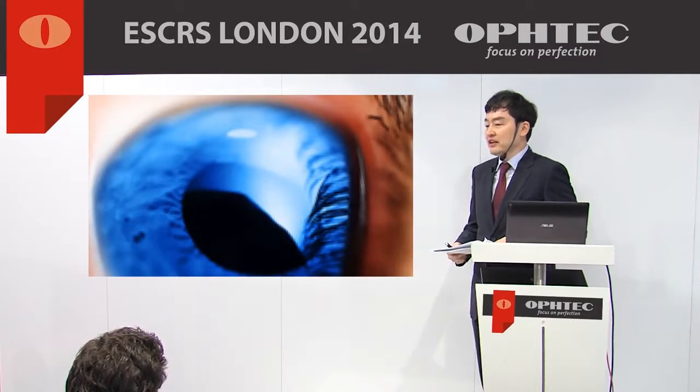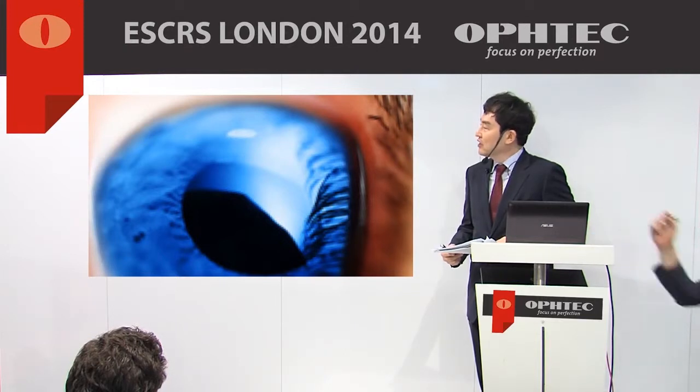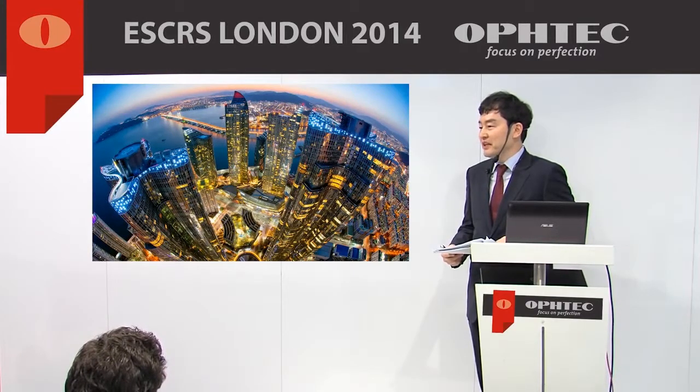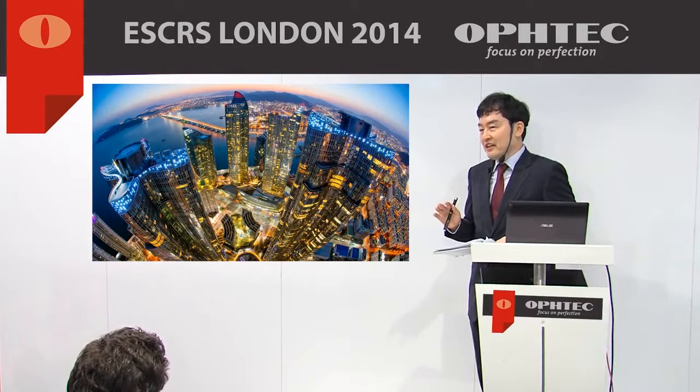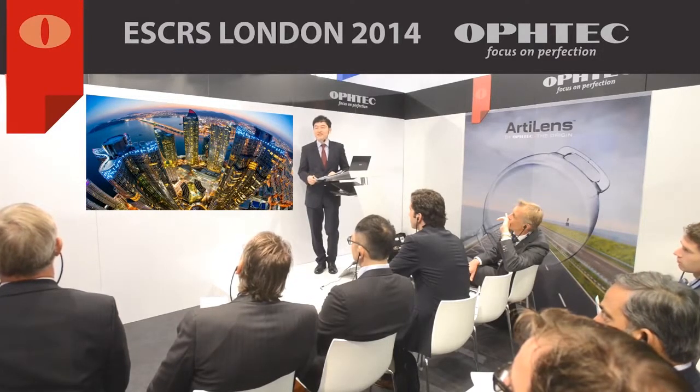I began Arti-Lens implantation in 2002. I performed the surgery based on anterior chamber depth measured by A-scan. Since 2011, I began to feel that I was not a beginner anymore. Regarding Arti-Lens implantation, I was able to analyze the anterior chamber. Therefore, I think that the most important virtue for an Arti-Lens surgeon is to have their own way to analyze the anterior chamber. Thank you very much.